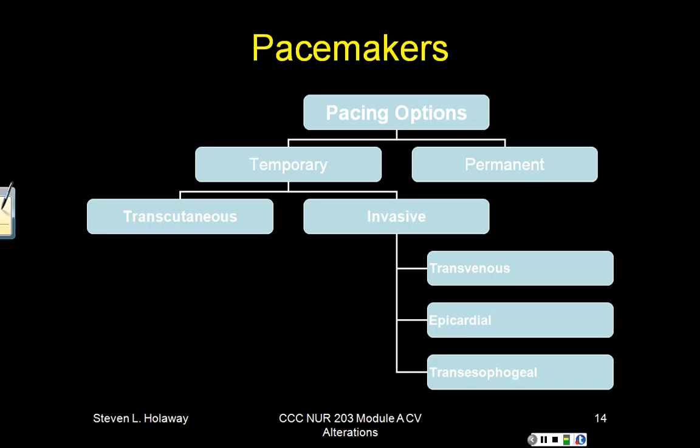So how do we decide whether we're going to use transcutaneous or invasive pacing? That basically is going to be dependent on the situation and what you have available. Again, we talked about the transvenous pacing. It's going to be more in your critical care areas, where your transcutaneous pacing is going to be more in your emergency rooms and on your ambulances to be used as a part of the ACLS treatment for patients with cardiac issues.